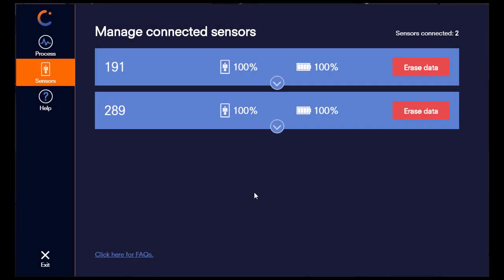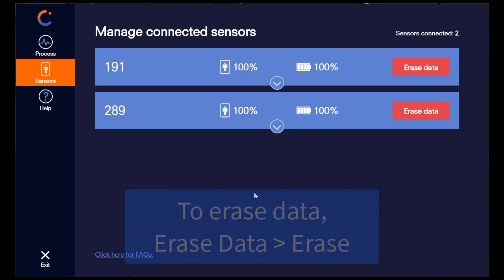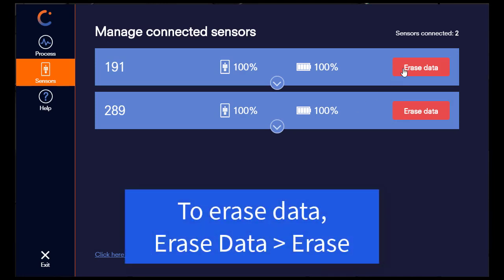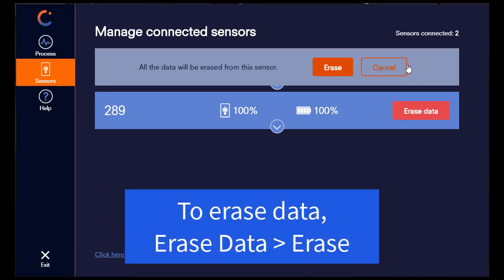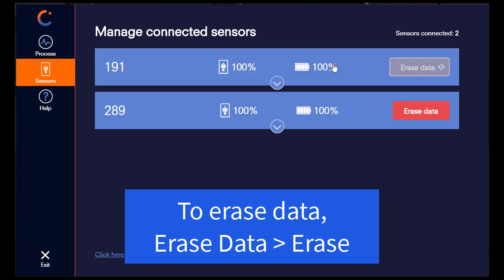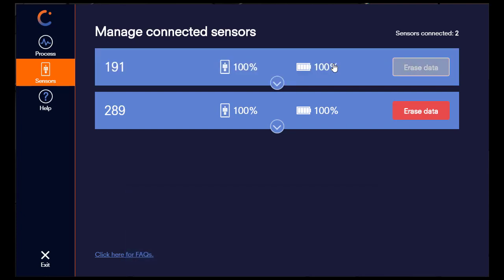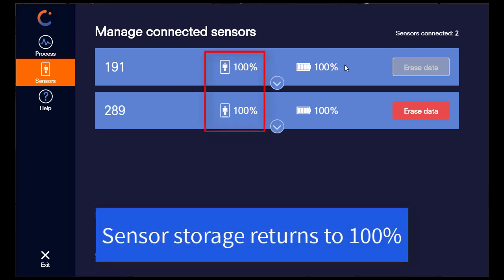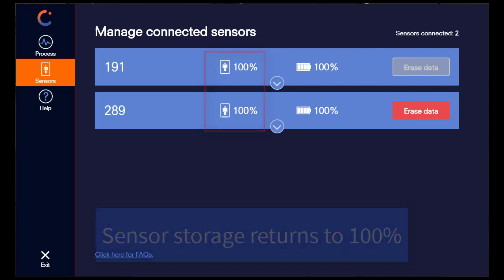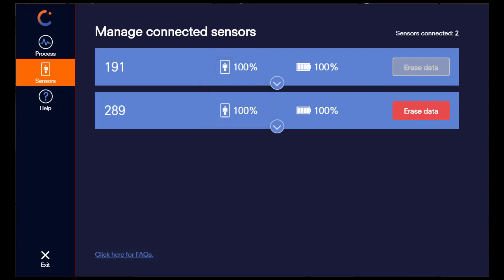Should you wish to erase data from your sensor, click on erase data and then it will ask you to confirm whether you want to erase the data from the sensor. Click erase and you will now see that there is no more data available on this sensor. Had the sensor displayed less than 100% storage prior to erasing, this would now return back to 100% after erasing.